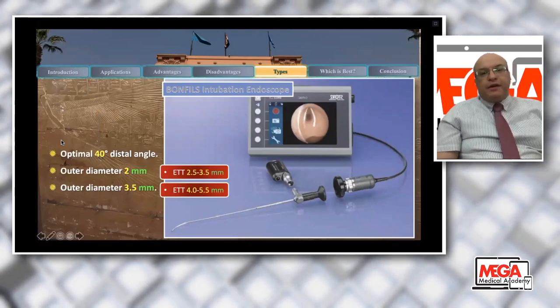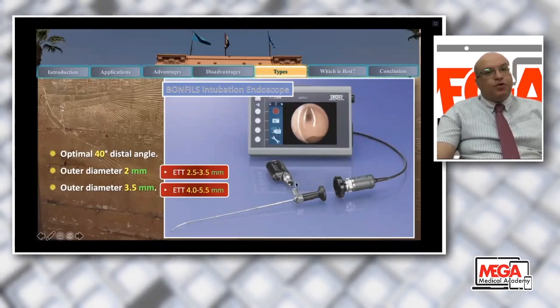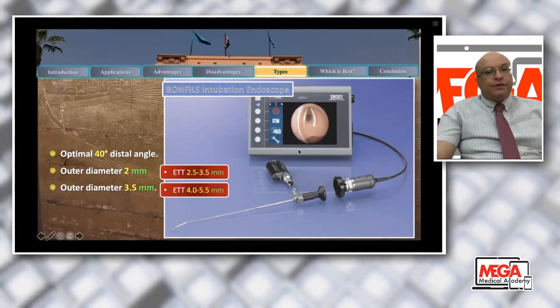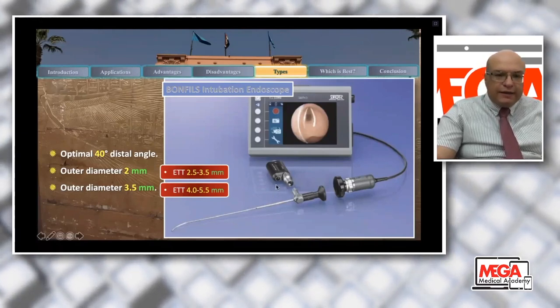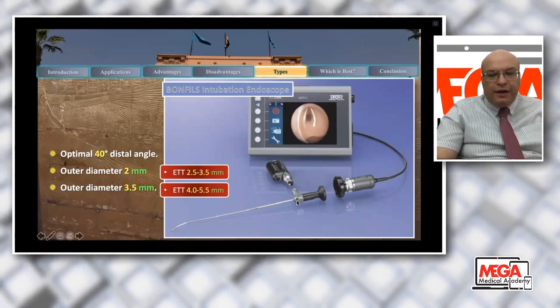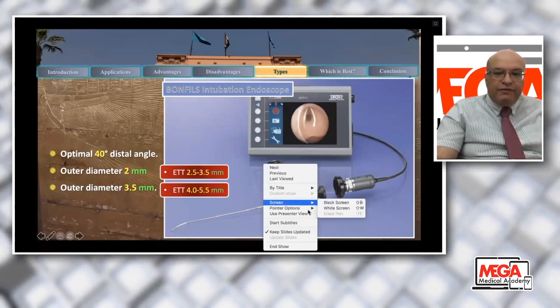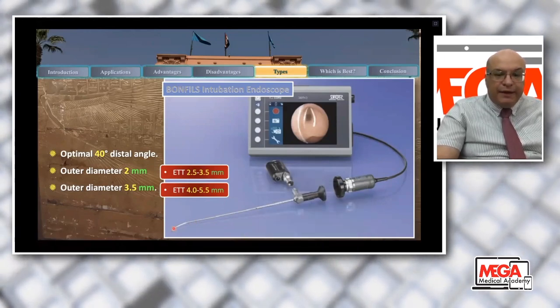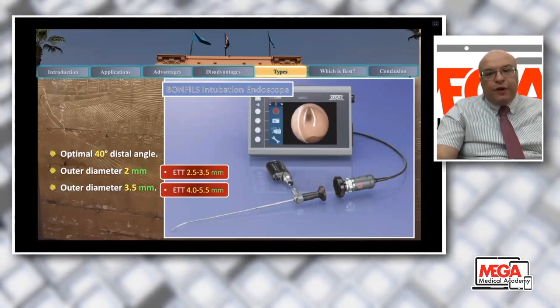Bonfils comes from Storz, and it has a portable light source, or you can use any light source from Pentax or Storz at your theater. There is an eyepiece here, with an option for providing oxygen. You can see it is a rigid shaft, and we also have an angulated tip here. There is an eyepiece, usually connected to a camera system.